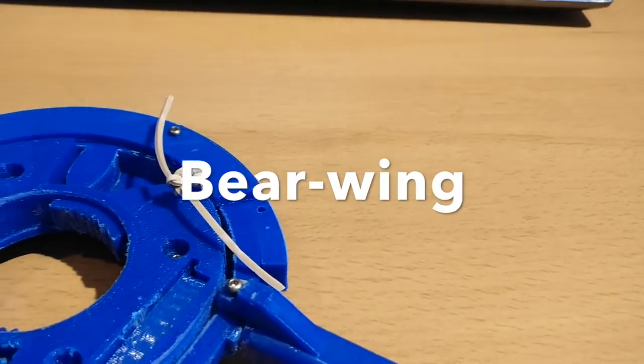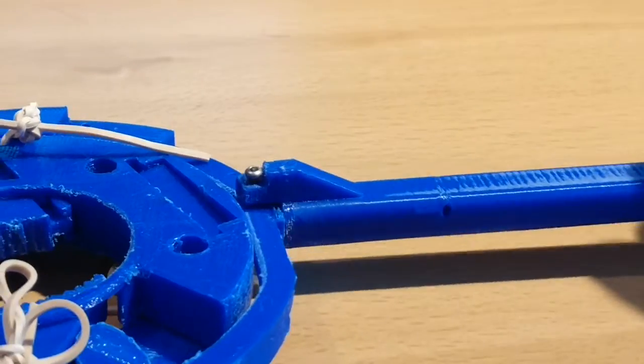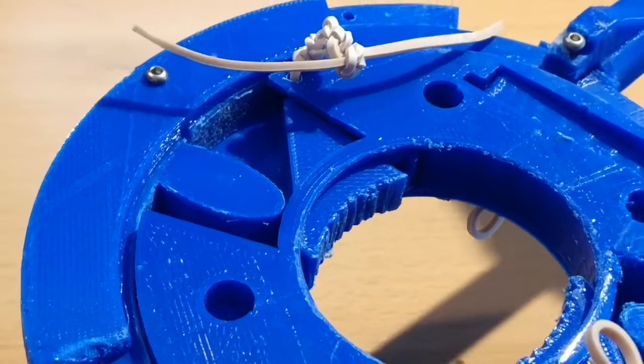We introduce Barewing, a simple-to-use adaptive device which gives users the ability to easily open bottle caps. The innovative yet simple mechanism converts the user's rotational movement into a linear movement, allowing the device to secure itself onto a bottle cap.